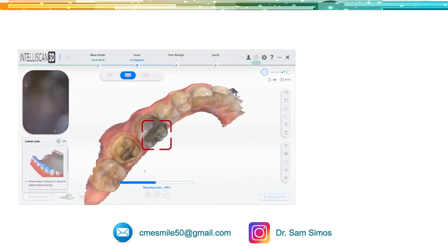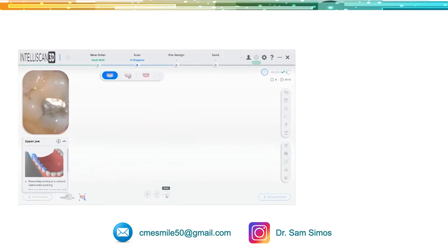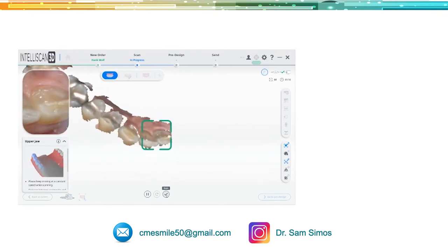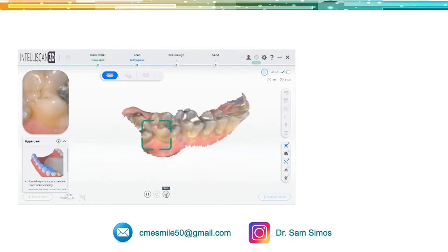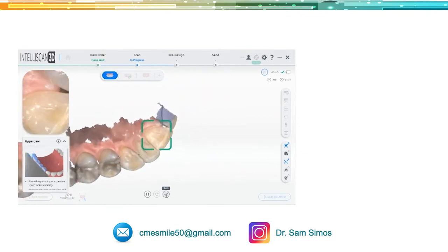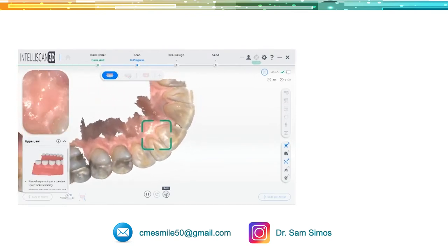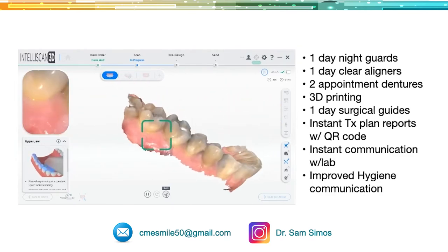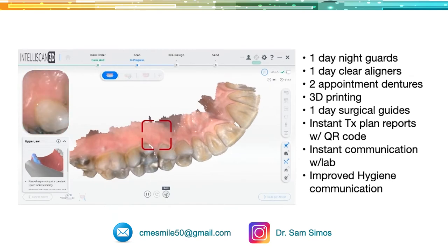What you're seeing on the screen right now is digital intraoral scanning, where we can actually take a scan of the patient in real time. What you're seeing is the IntelliScan 3D. There are many good scanners on the market that are very adequate. We use two or three different scanners in our practice, but the hygienist can use this, the assistant can use this to really communicate with our patients and offer fantastic dentistry. We can offer one-day night guards — our hygienists can take a scan, 3D print a night guard, and have it ready before the patient leaves their hygiene appointment.